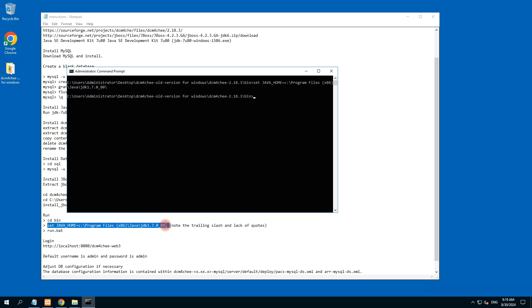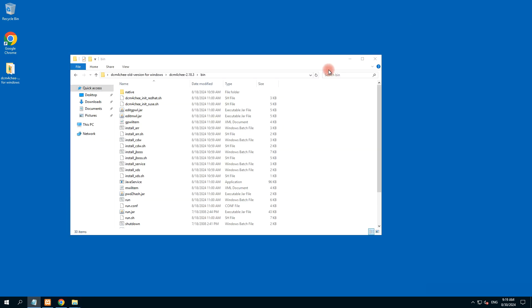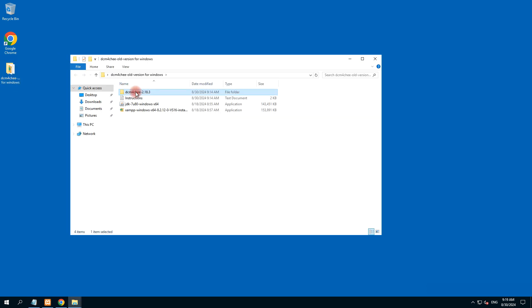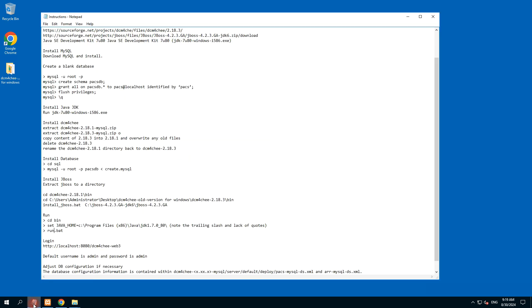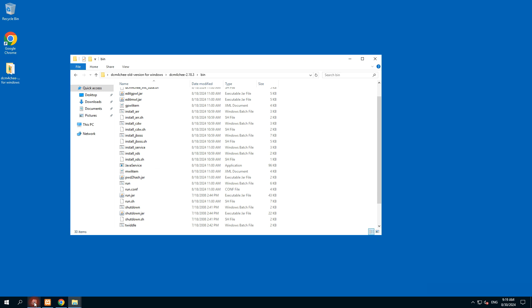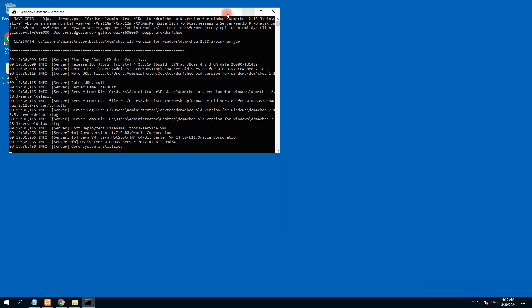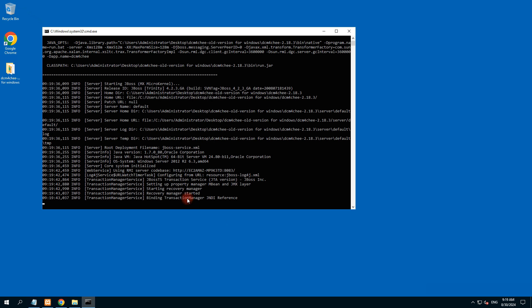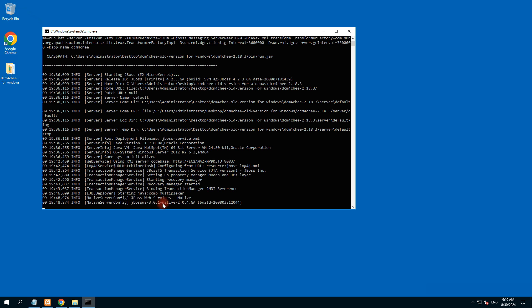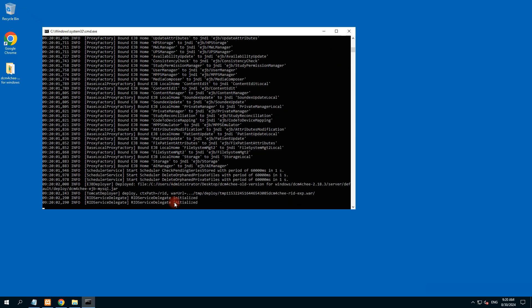Java is exported through this command. Now we manually run the 'run.bat' file. Close the other windows, double-click on the DCM4CHEE folder, go to the bin folder, and we need to run 'run.bat'. Double-click on 'run.bat' — it is initializing. Our DCM4CHEE service is starting now. Let's wait until the JBoss web services are generated and started.